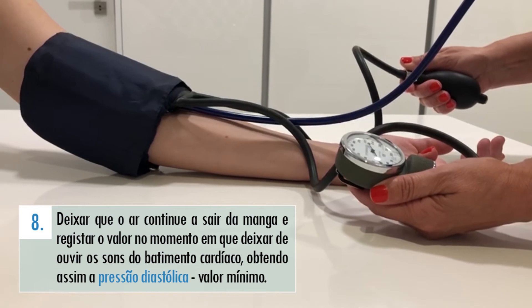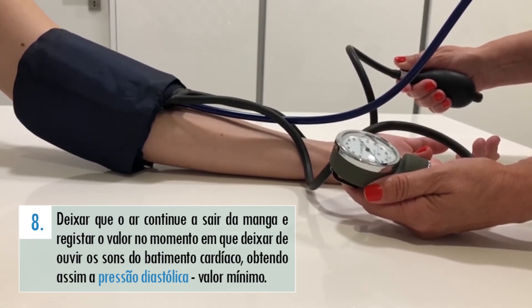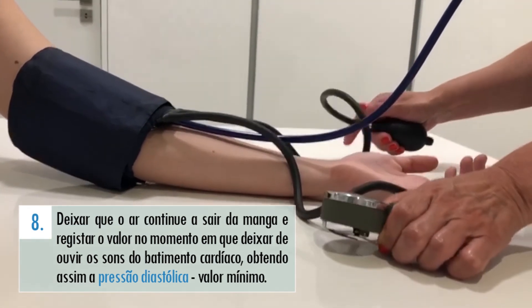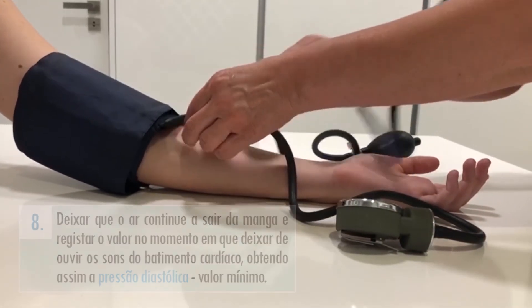Ao deixar que o ar continue a sair da braçadeira, chegará uma altura em que deixará de ouvir os sons do batimento cardíaco. Deve anotar o valor que o barómetro indica, pois este corresponderá ao valor da pressão arterial mínimo, ou seja, ao da pressão diastólica.